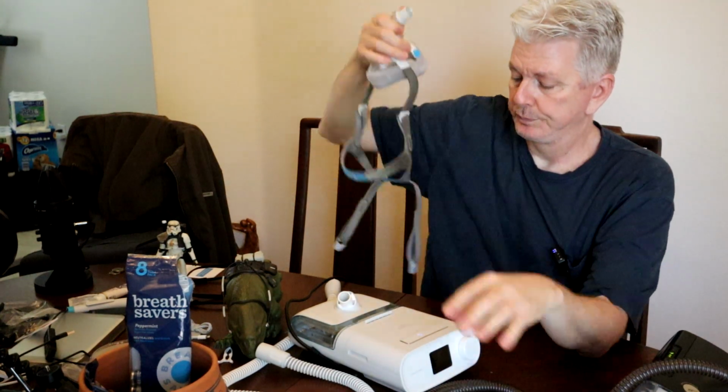Okay, next we're going to do the Philips. Now the Philips, in my humble opinion, makes a little bit more noise than the ResMed. And when I say noise, I'm not saying it's noisy at all, because it's not. It's just a little bit of humming. With the ResMed, you hear your breath going in and out, and that's just breathing. With the Philips, you hear your breath going in and out, but it makes just the slightest little hum. I don't even know if I can show an example of it, but when you use it for a while and you have the machine next to you, you know what I'm talking about.